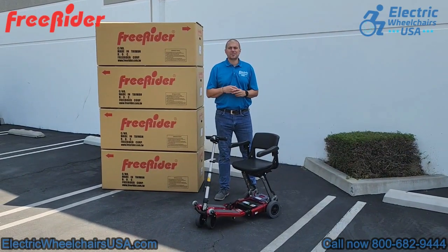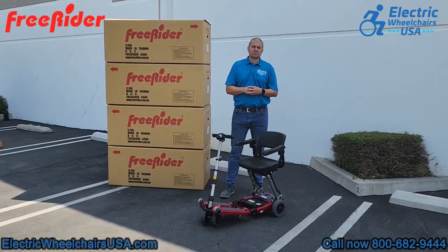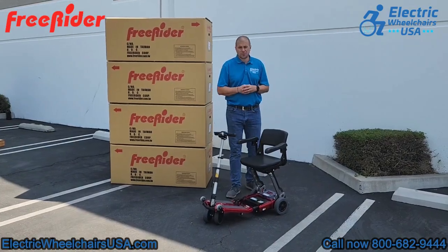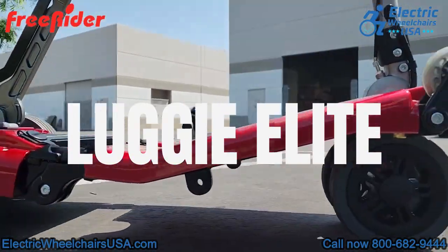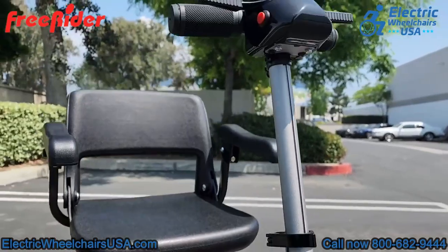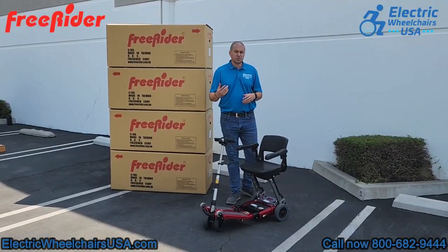Welcome to the Electric Wheelchairs USA Mobility Experts channel. Today we're visiting Freerider's corporate headquarters and in today's video we're going to go over the Luggy Elite. It's a foldable scooter within their Luggy line that can support up to 320 pounds of weight. It's airline approved and it comes in multiple colors, so let's show you a little bit more about it.